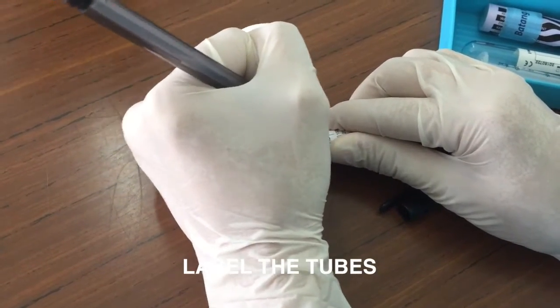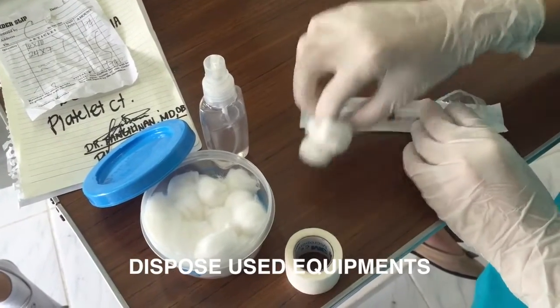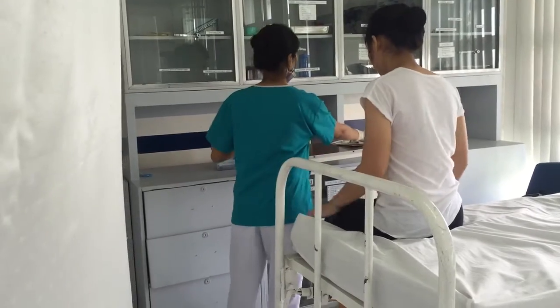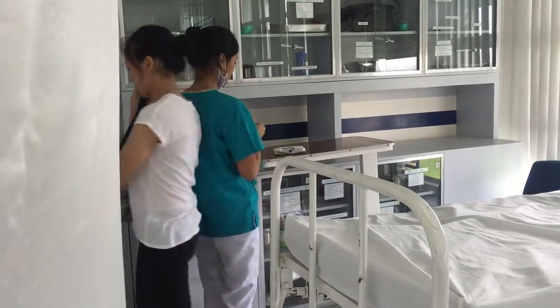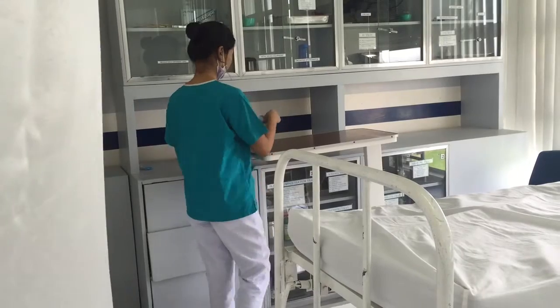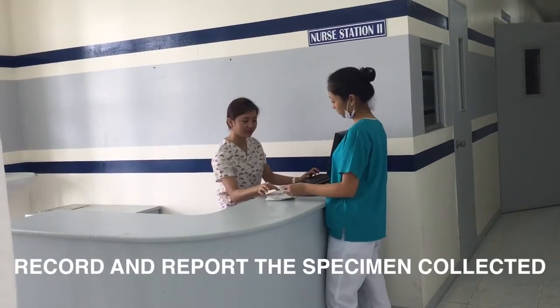Label the tubes with the patient's information. Dispose of used equipment. Record and report the specimen collected.